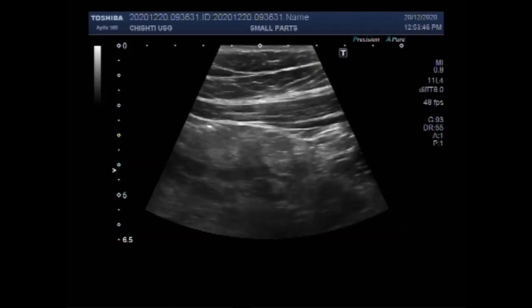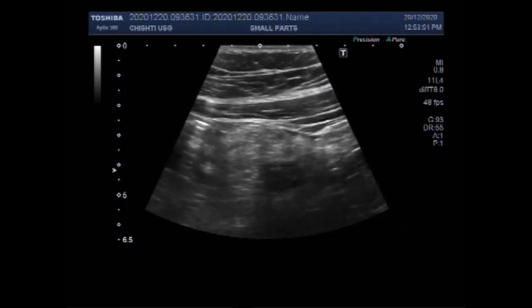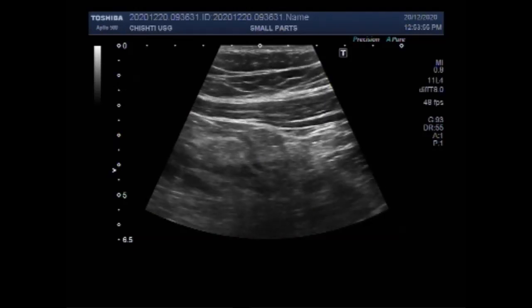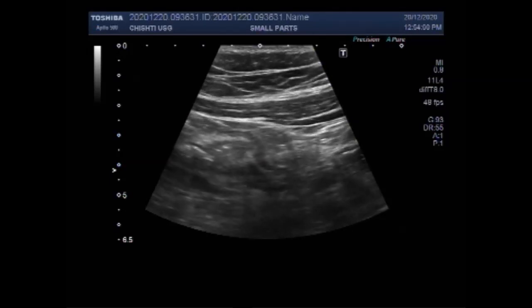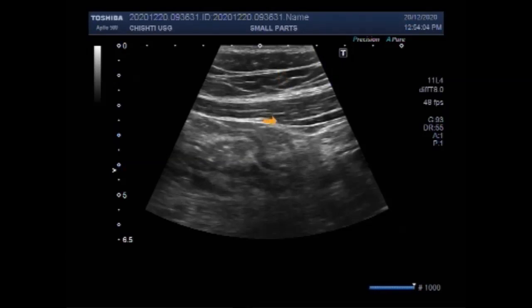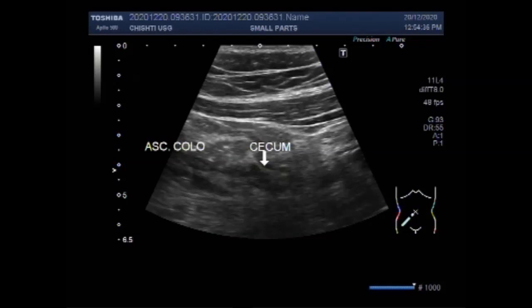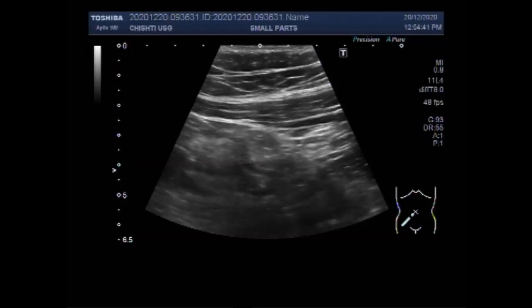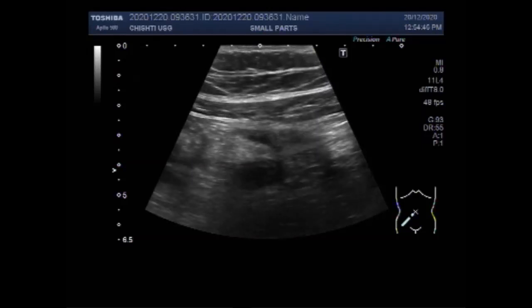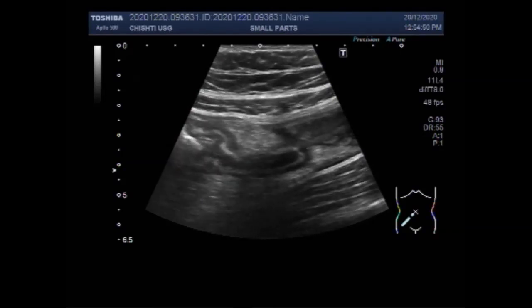Now you will scan inferiorly to localize the cecum. You are going to see the cecum attached to the lower end of the ascending colon. This is the cecum and this is the ascending colon. Now at this point, when you have focused the cecum, you will sweep the probe around to find the acute or inflamed appendix.